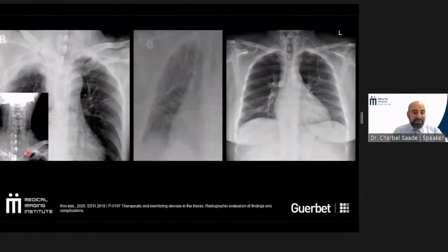And then sometimes when you see that you can't see a proper central line, you'll see it coming up, it can go straight up into the neck. Or sometimes it can actually go down into the wrong area and it can go high up and it'll be dislodged and move backwards because they didn't hold it properly. This is also another concern. So whilst with the central line we always assume it's in the perfect position, it's not.